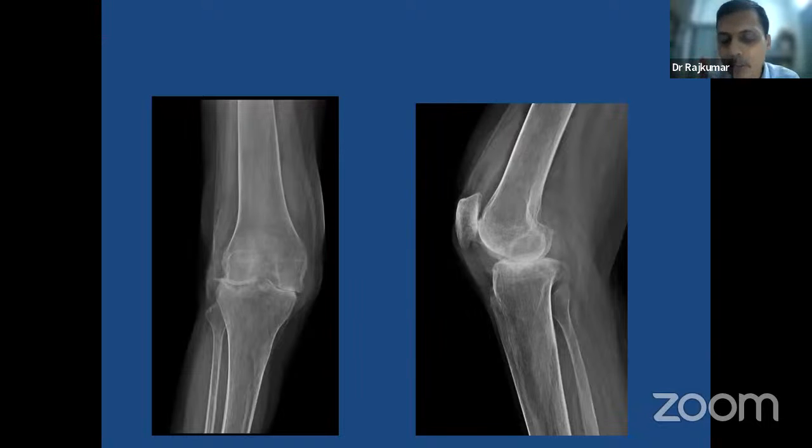So this is the case. We have to be very careful in the balancing. And also one important thing I will say is, I will not try to take too much bone from the femur. This is the case where you try to get balancing by taking too much bone from the femur and then have an instability. That becomes a very bad nightmare to balance, and he will end up in an unhappy situation and his FFD will never correct.